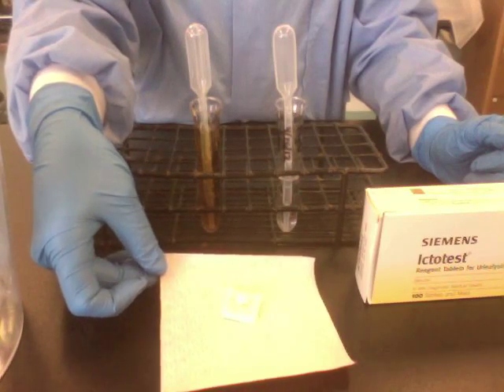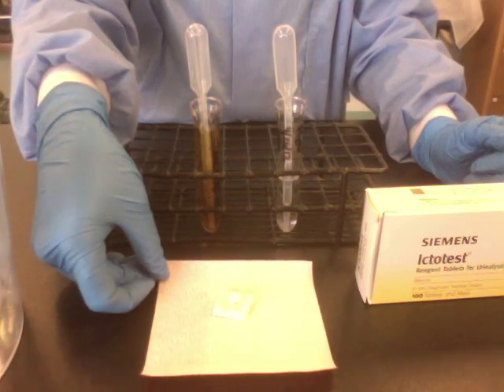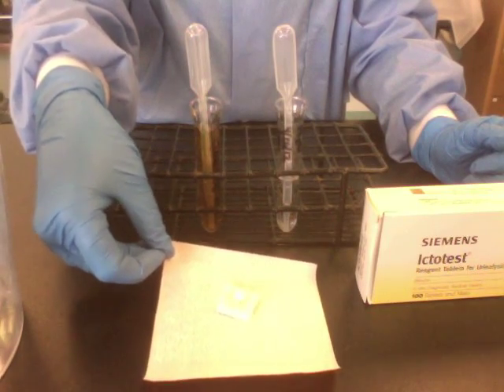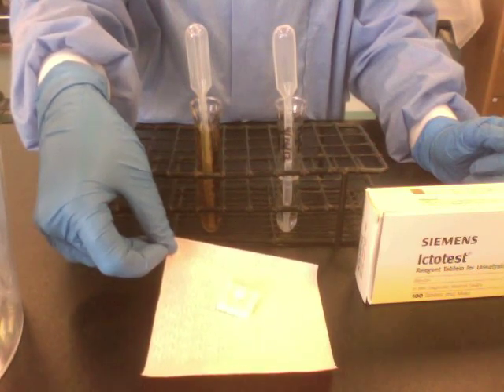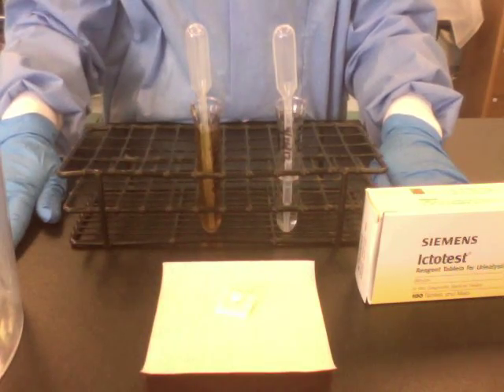A positive reaction is going to be a dark purple indigo color, whereas a negative reaction is either going to just stay yellow or be a sort of pink-red color. And that is the Ictotest.